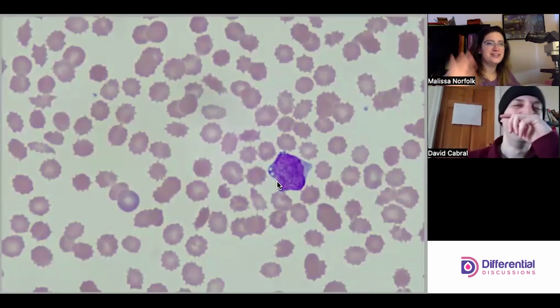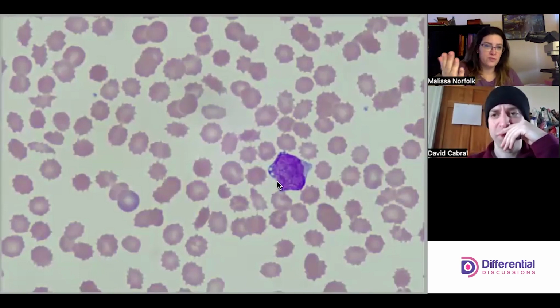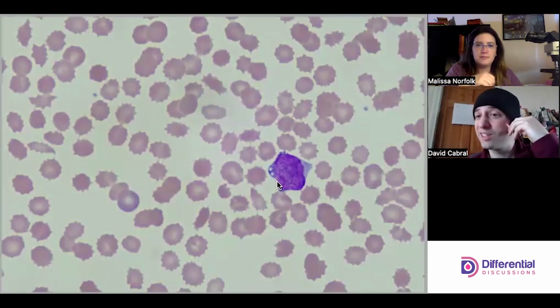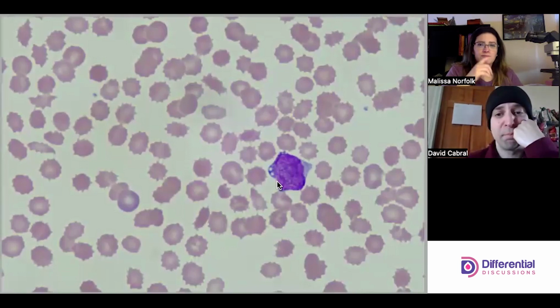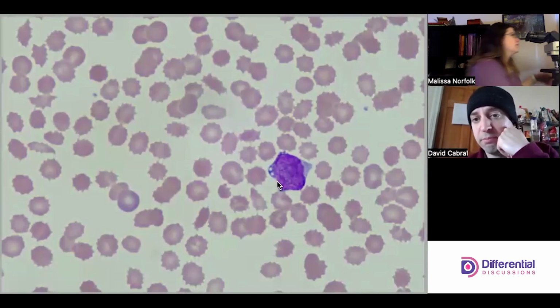It's a blast. I just said that because vacuoles, and this is one of the examples of why you can't say if it's vacuoles, it's a mono. Yeah. That is one piece of evidence. And honestly, not even that strong of a piece of evidence. Vacuoles, I don't put a ton of stock in them. But they can occasionally be helpful, but generally in a slide like this, they are not going to be helpful. There'll be more noise than signal. But yeah, good looking blast.